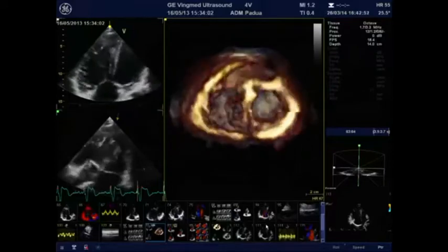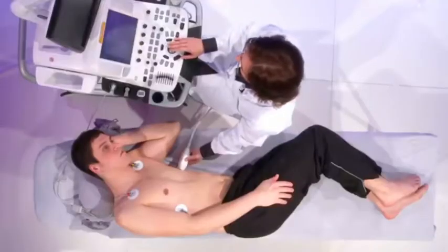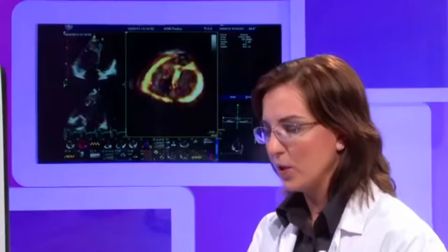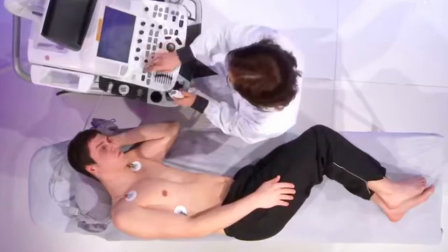If you would like to assess also the regurgitation, it can be done either in 2D or in 3D. We can first assess it in 2D echo, and then I will switch to 3D echo in order to show to you the added value of assessing the area of the regurgitation of the jet. So changing again the probe for 2D examination.